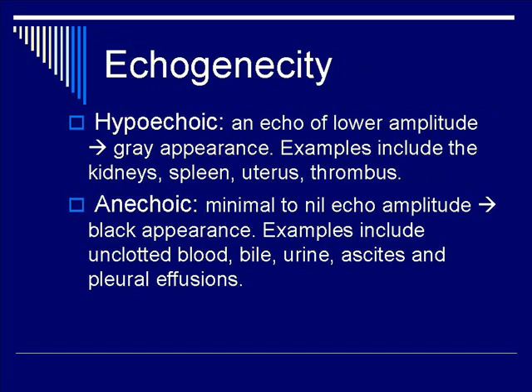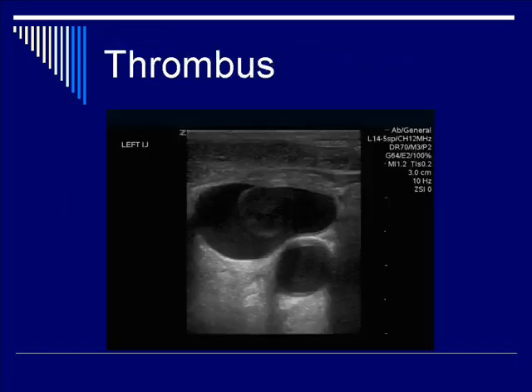This next structure is an image of a patient's carotid region. On top, the vessel is the internal jugular vein on top of the carotid artery. Within the vein, the venous structure, you see there is a hypoechoic structure surrounded with anechoic fluid.